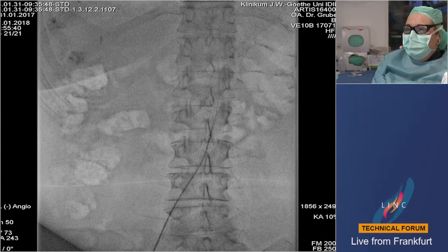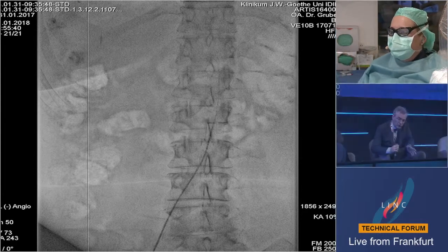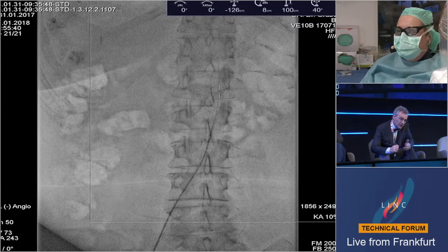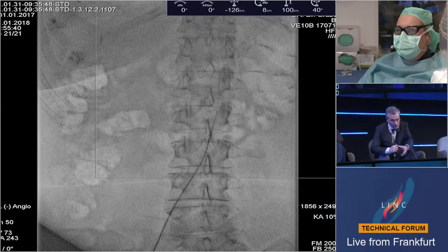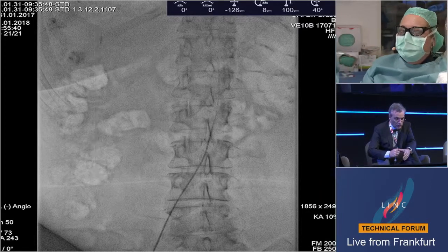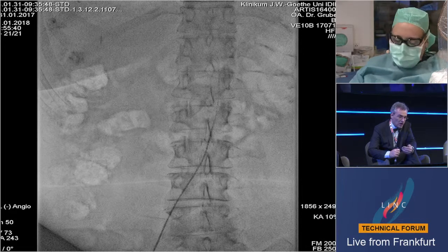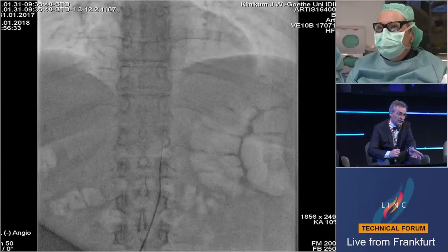Unfortunately, we haven't seen any CT or MRI for the HCC. Could you just explain to us, is this a hypervascularized HCC? How was the result of your first TACE? Was this a combination chemotherapy in your first TACE? What are we dealing with today in your intervention, please?